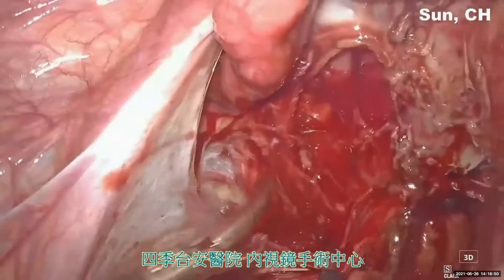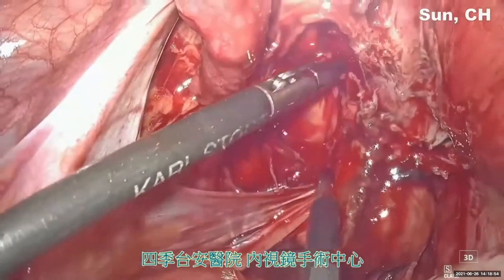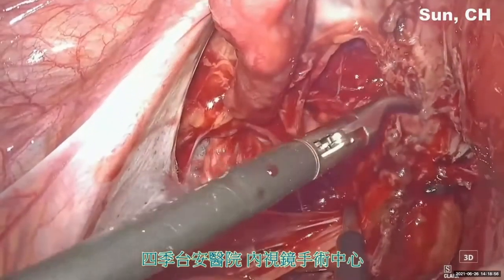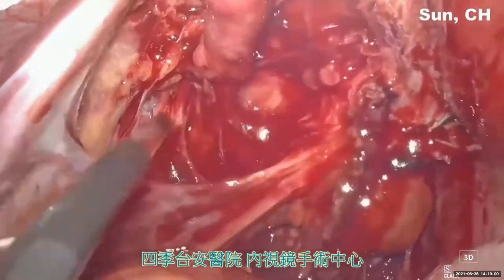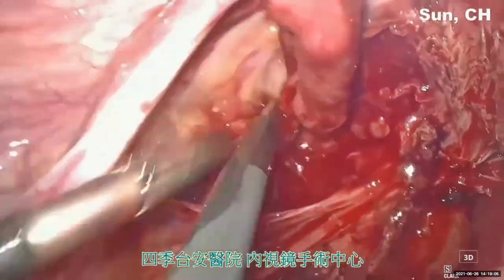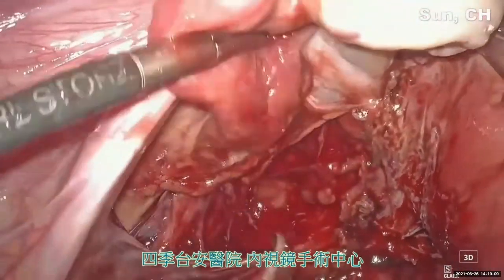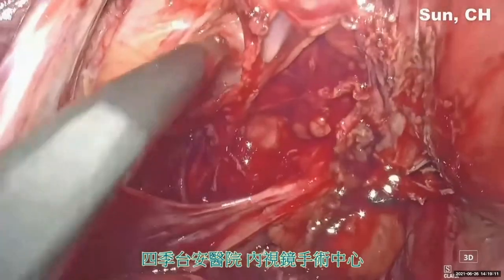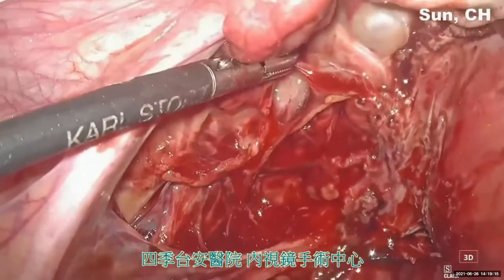Now we are between the ureter and the uterosacral ligament, which is the so-called Okabayashi pararectal space. We have to take care not to injure the uterine vein here. Okay, now we are going to enter the paravesical space, which lies anteriorly to the uterine vessels. So now we are trying to find out where the uterine vessels are.